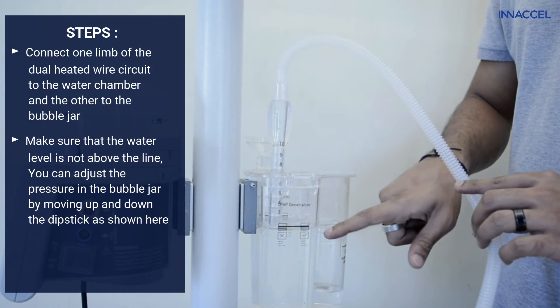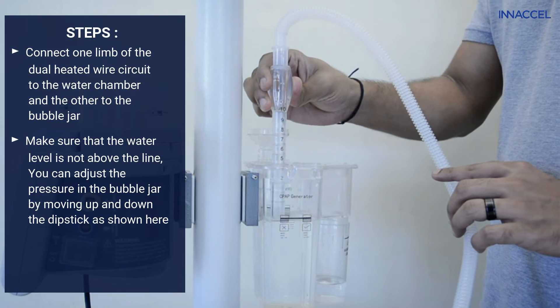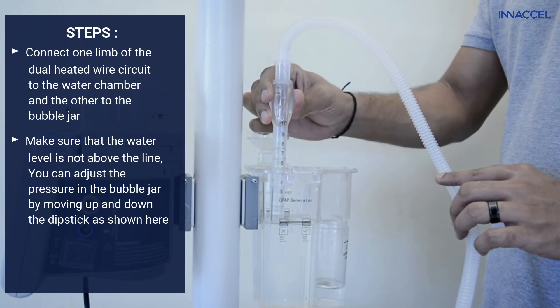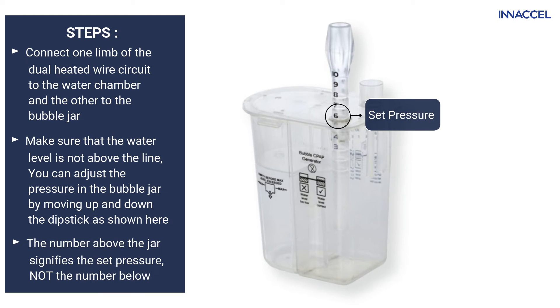Make sure that the water level is not above the line. You can adjust the pressure in the bubble jar by moving the dipstick up and down as shown. The number above the jar signifies the set pressure, not the number below.